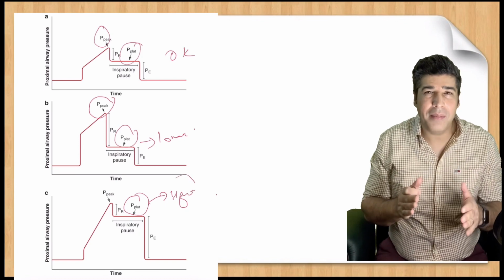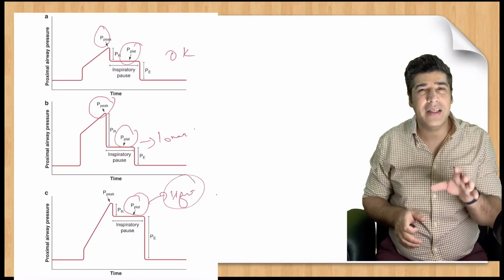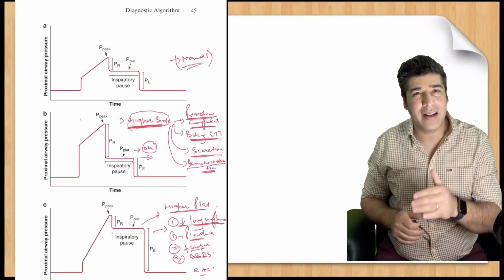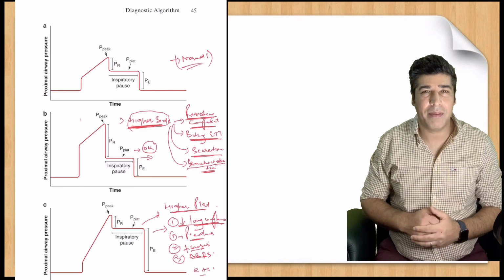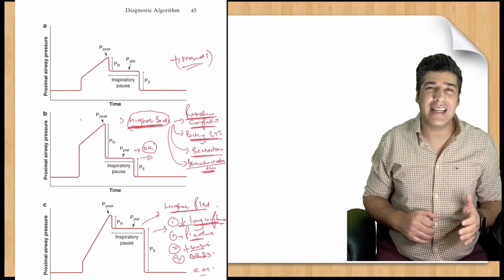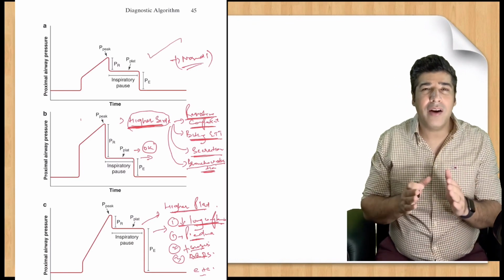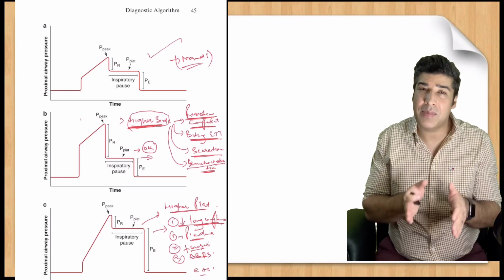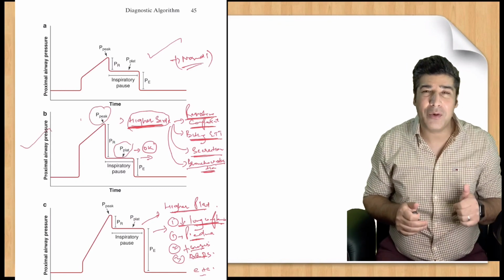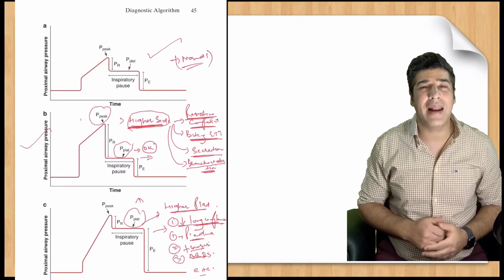Now, to make it more practical, when you go to the patient and see the patient on a ventilator showing increased peak airway pressure, this increase could be a result of the resistive component or the elastic component. So in order to get it more precise, you have to make sure that you do the inspiratory pause to get the plateau pressure.